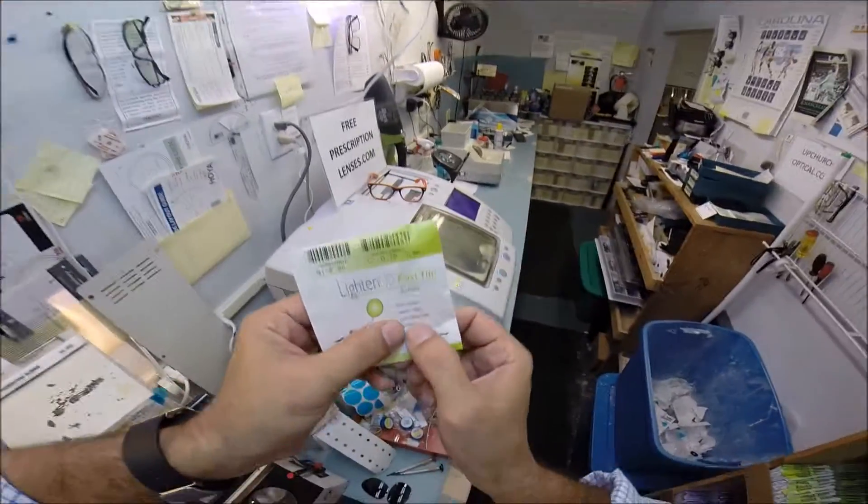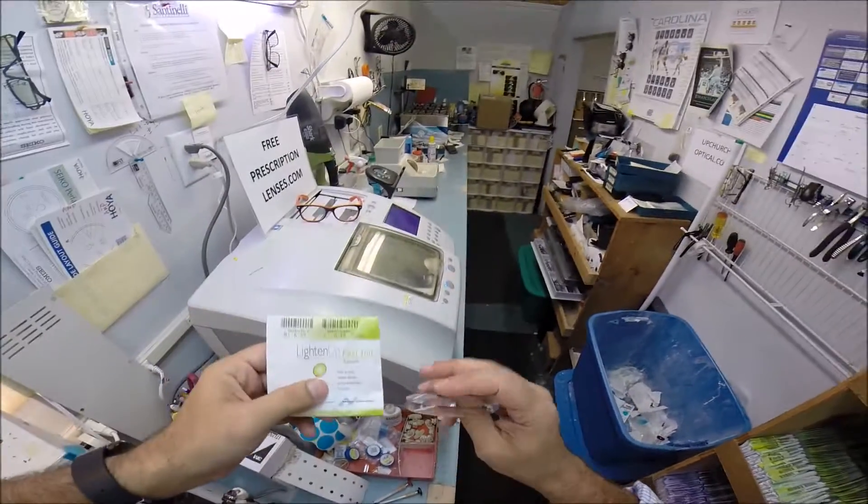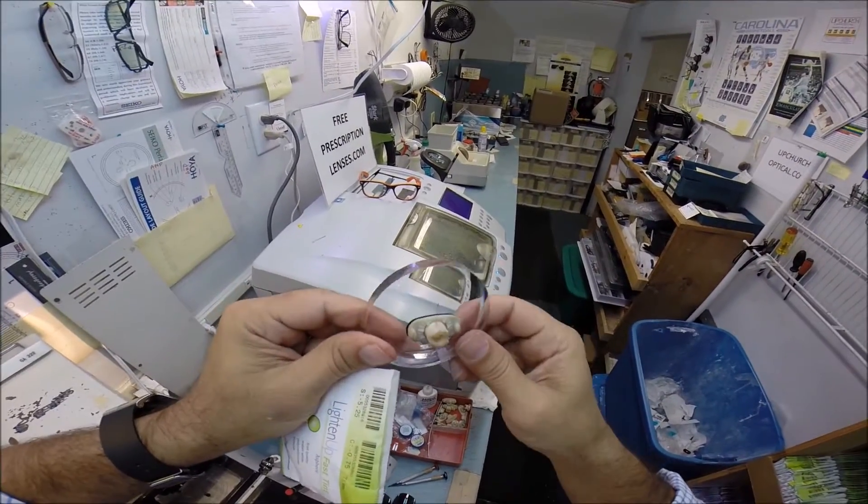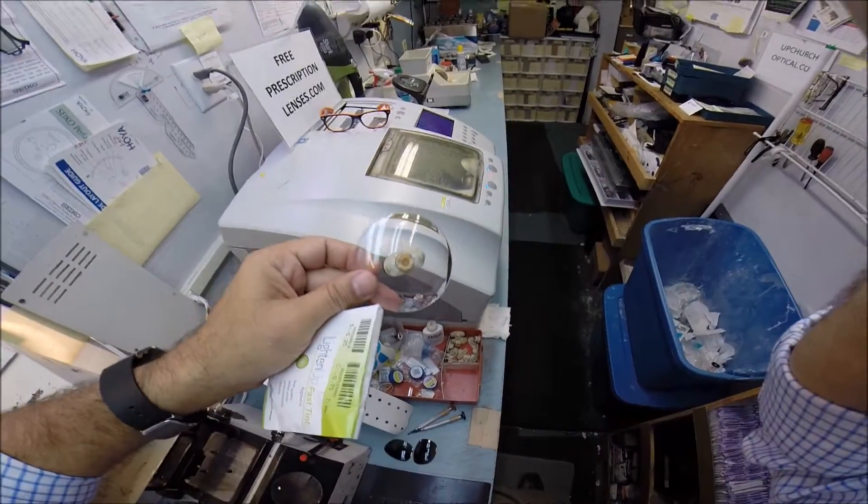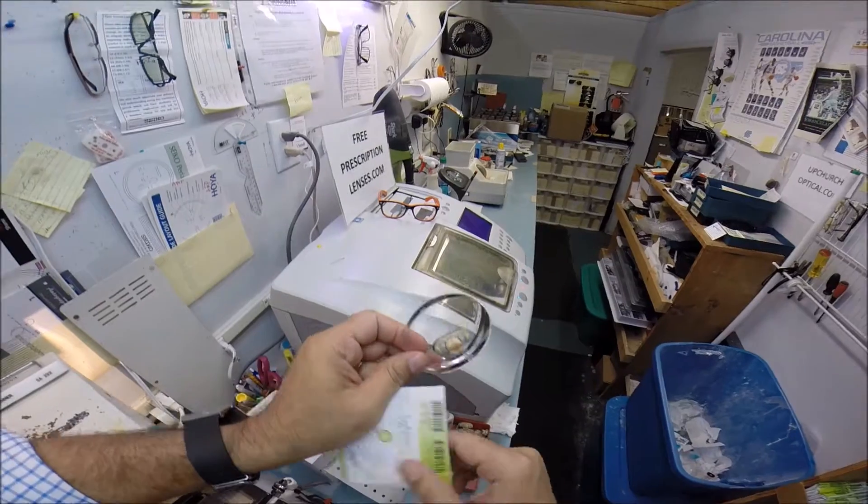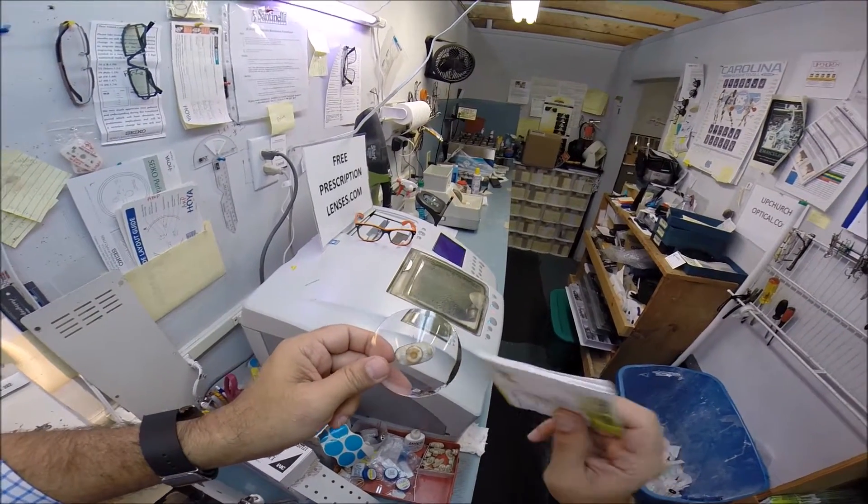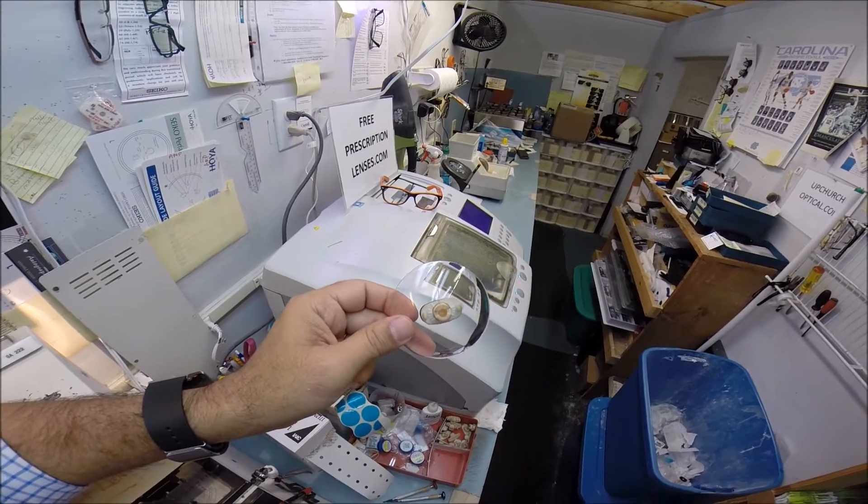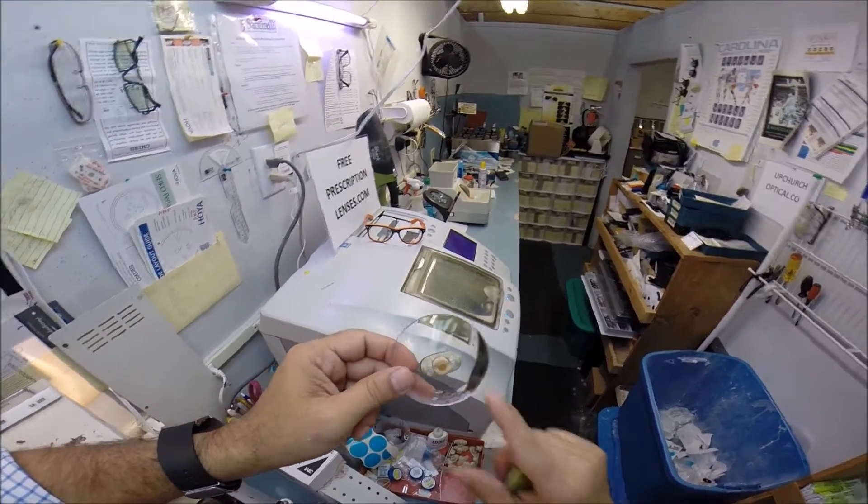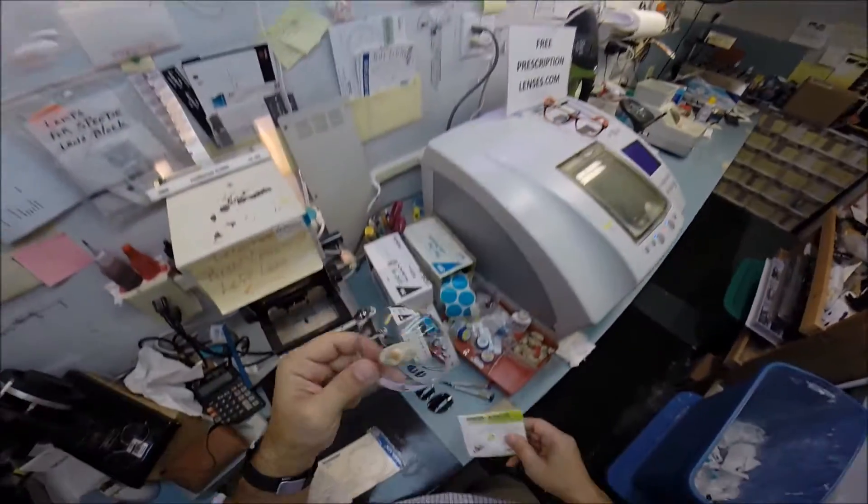So your lenses are made out of polycarb. Polycarb is 40% thinner and lighter than regular plastic. It is virtually unbreakable and bulletproof up to .22 caliber. It also has both UVA and UVB protection built into it. We know what the sun's harmful ultraviolet rays can do to your skin, where your eyes are eight times more sensitive than your skin, so you have permanent sunscreen for your eyes. That UV protection is what's going to offset or delay you getting cataracts late in life.